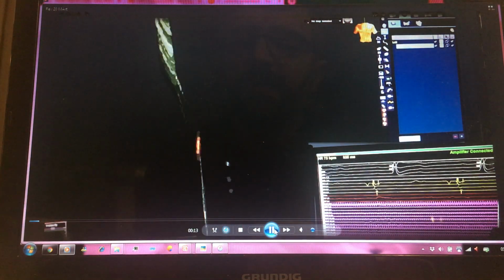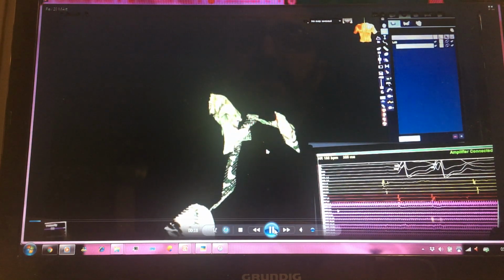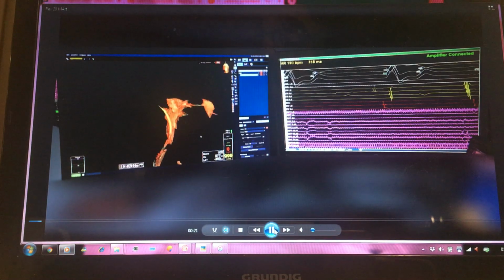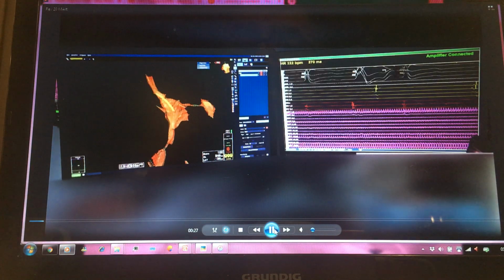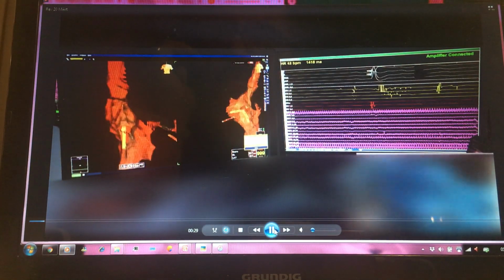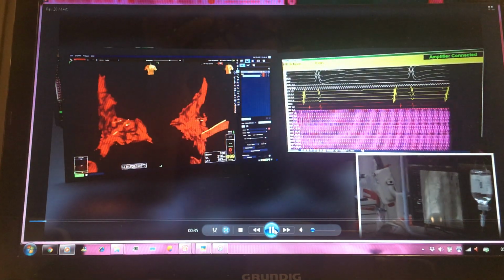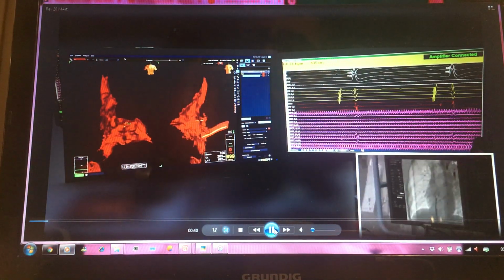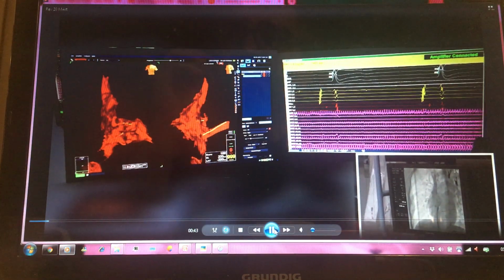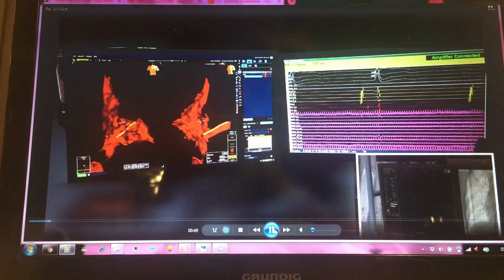After inserting the sheaths, we usually try to get anatomical mapping of right atrial structures like the superior vena cava, right atrium, and inferior vena cava by using the coronary sinus catheter. During this time, we do not need activation or voltage mapping of right atrial structures. This mapping is just to check the close relationship between right and left atrial structures during the procedure.